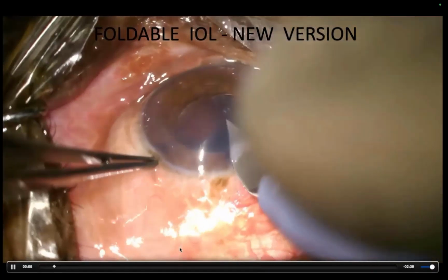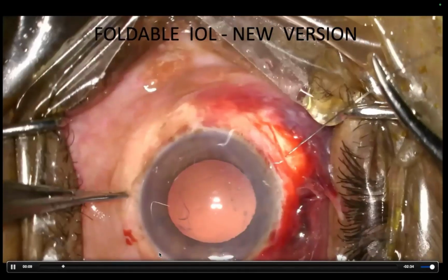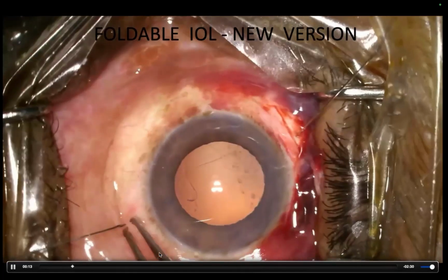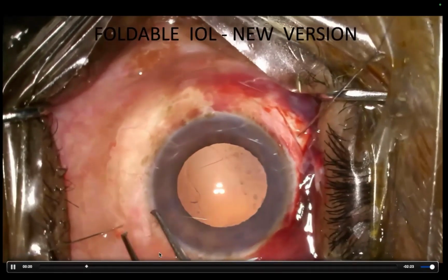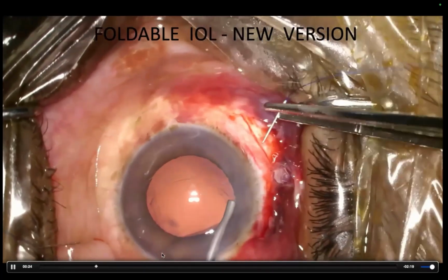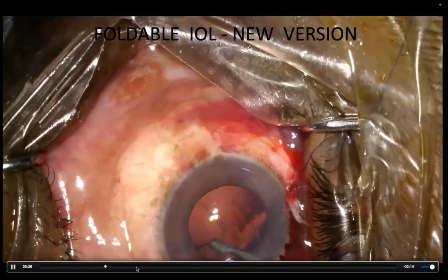So it's a 3.2 mm keratome with which I make an incision. I make it a little larger so that the IOL goes inside comfortably. So 2 mm behind the limbus, sclerotomy is done using the spatulated needle, and it is done on the other side as well. Both these needles are exteriorized through the clear corneal incision.